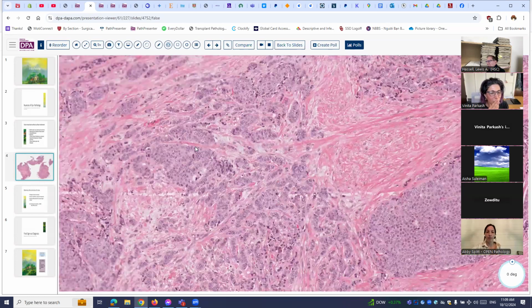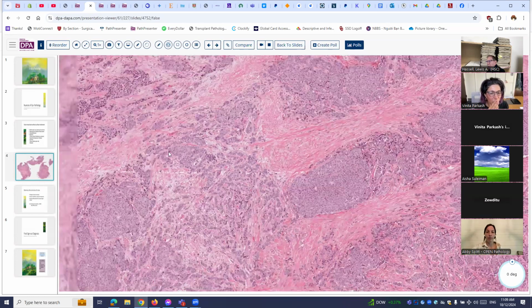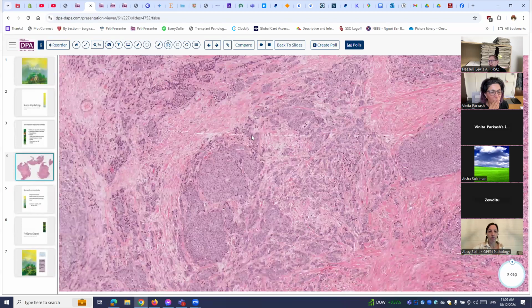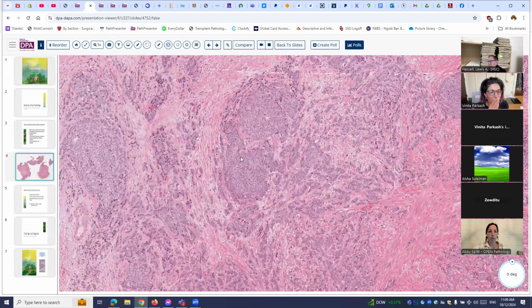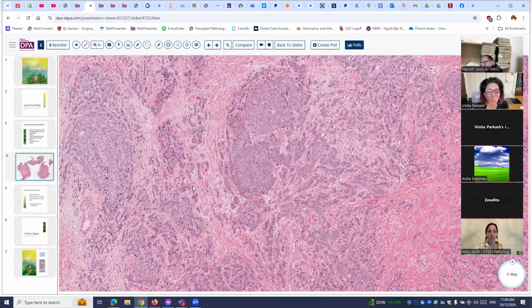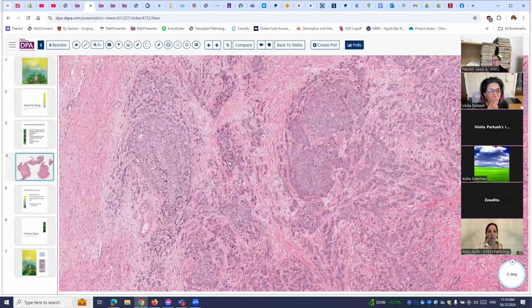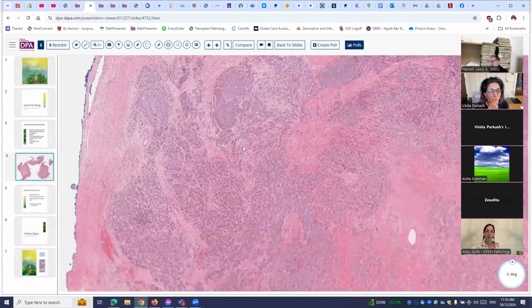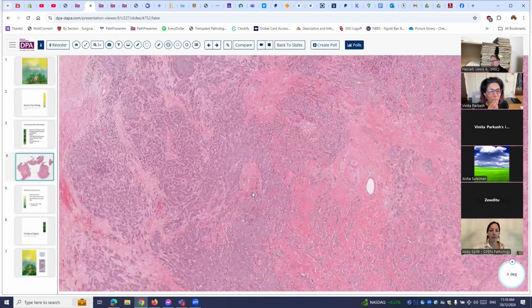It looks like it has neuroendocrine nuclear features. Yeah, so with the cords, I think neuroendocrine is a consideration. Not very common in the vulva. What else might you think about? Merkel cell. I'm sorry, could you say that again? Merkel cell carcinoma. Okay. Anything else? Breast.